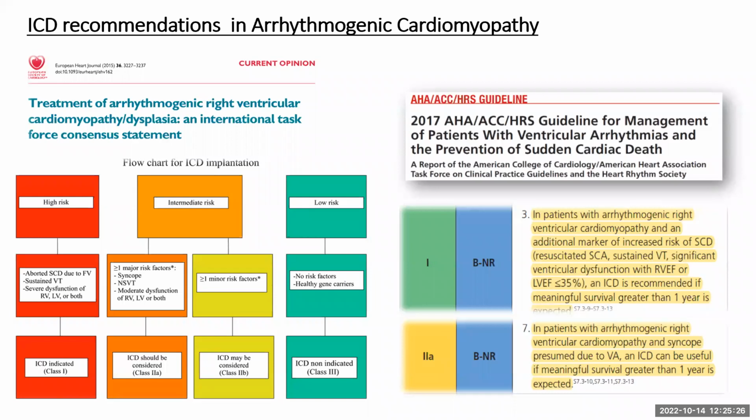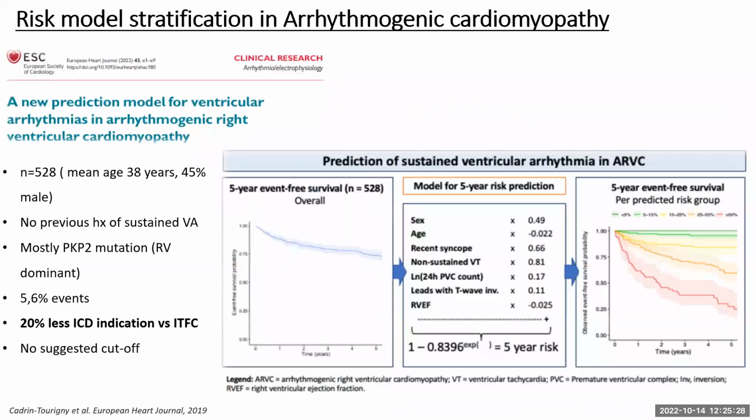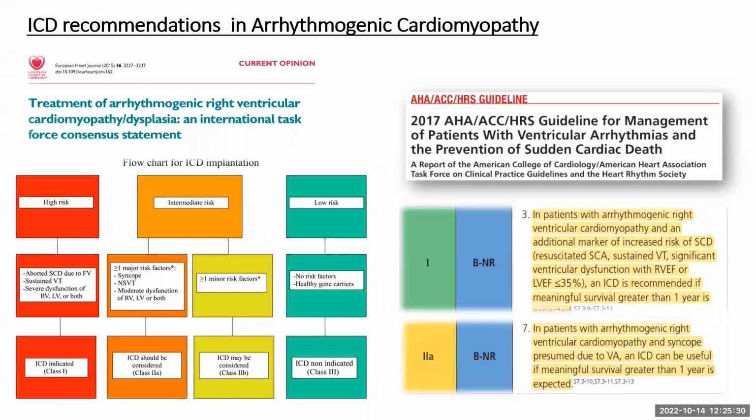So what about risk stratification in ACM? The question is, can imaging help? The actual recommendations are mostly based on expert opinions. In reference to imaging, they only mention RV or LV ejection fraction for risk stratification.